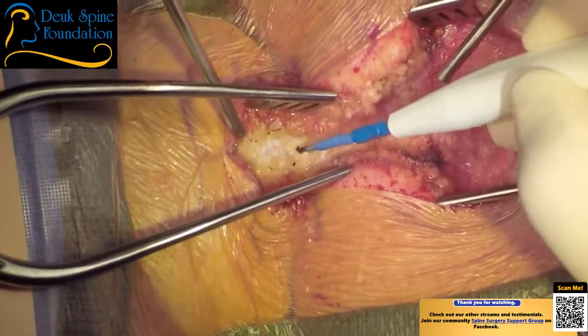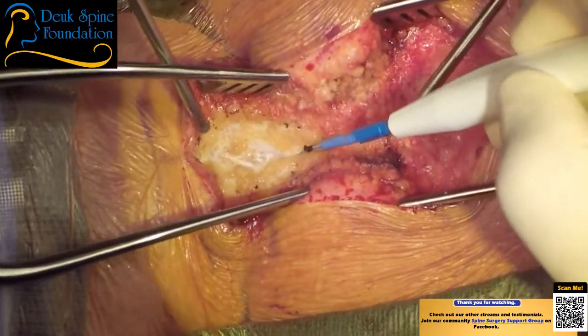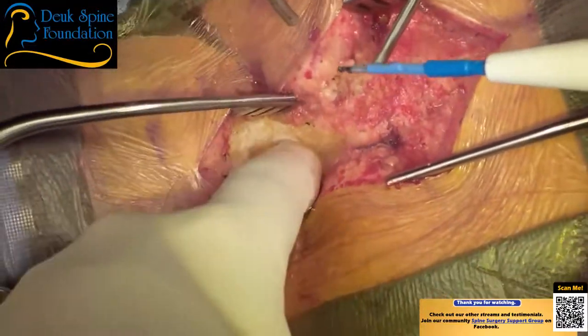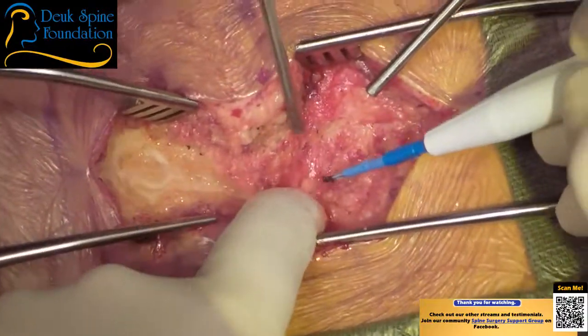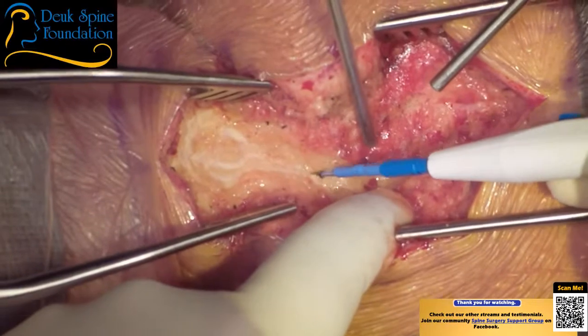So we haven't gotten to our dorsal fascia yet. We're still in the adipose tissue. If you draw your retractors too tight, you'll never feel the spinous process. I think that's C7 right there. C7 is going to be the most prominent spinous process.